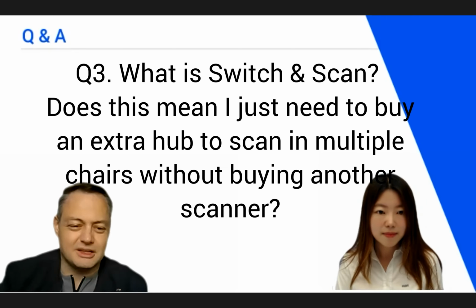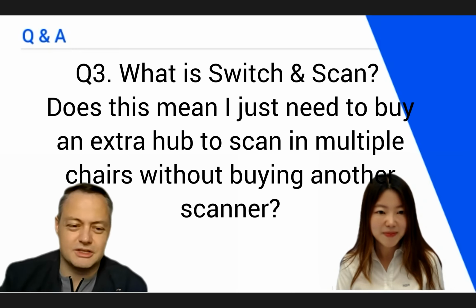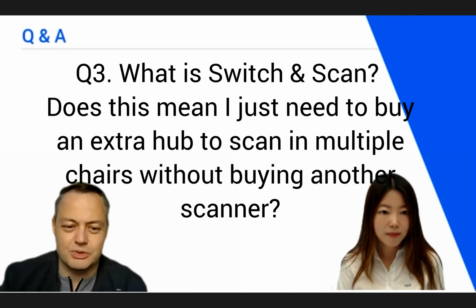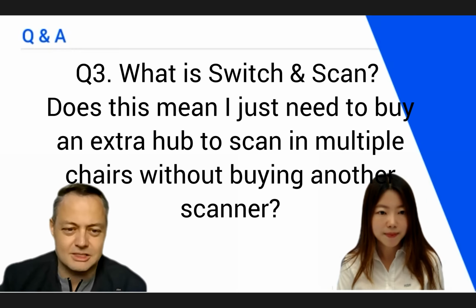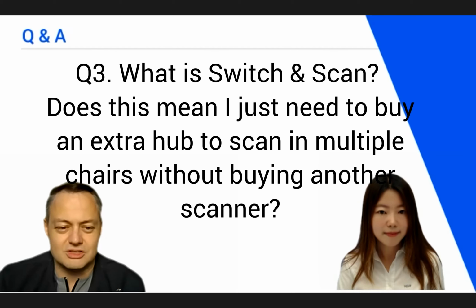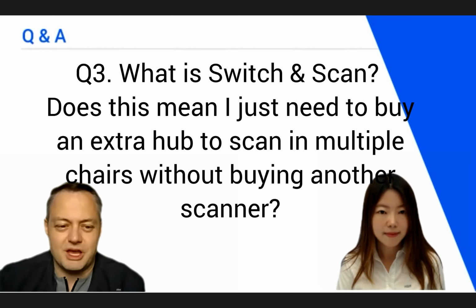So it's exactly the opposite situation from the second question. This switch and scan actually implies you have multiple computers, like a desktop in one operatory, a laptop in the next, and you just take your scanner with you, and it actually makes a lot of sense because you need computers for every doctor that is an employee of yours, and you just take the scanner from one room to the next and just pair it with a new hub.